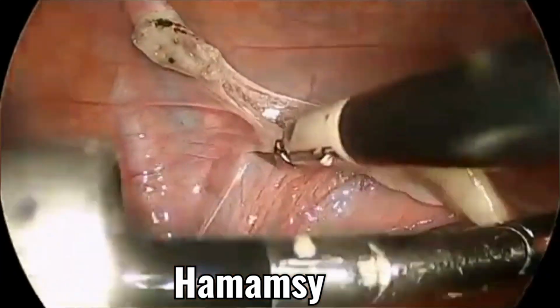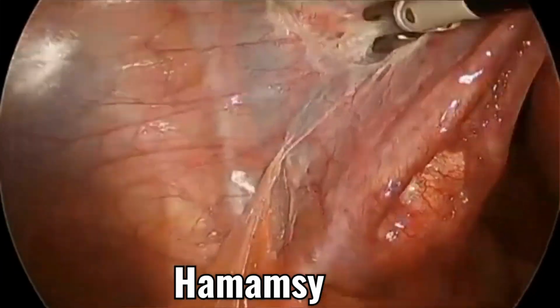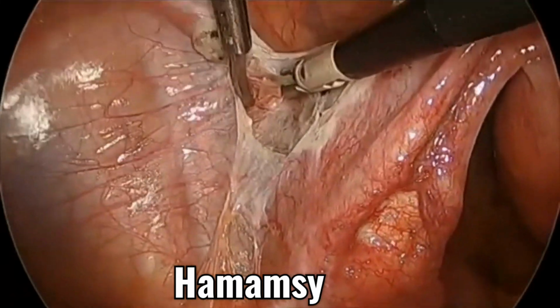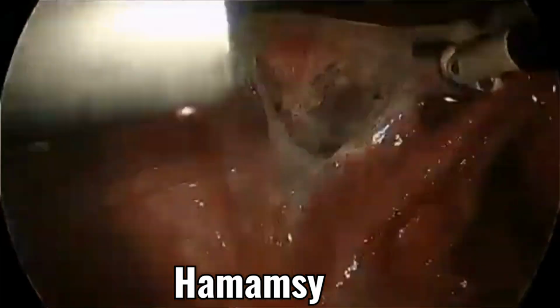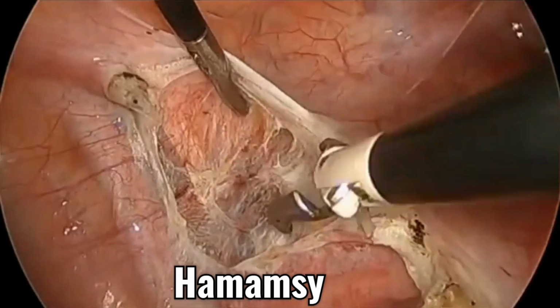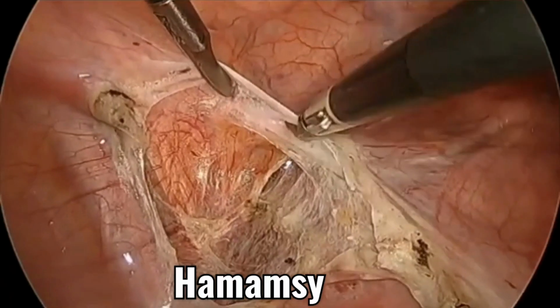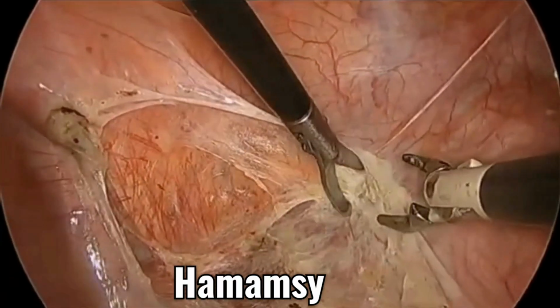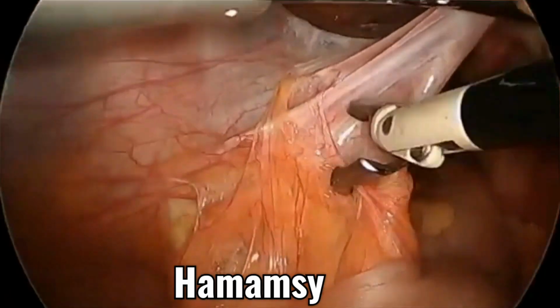The rules of laparoscopic pelvic lymphadenectomy: you must start firstly in radical hysterectomy by lymphadenectomy, not a hysterectomy. Then from lateral to medial, as you see, lymph node dissection is done from three main regions: external iliac lymph node along the external iliac vessels, obturator lymph node along the obturator nerve in the obturator fossa, and lastly, internal iliac lymph node along the hypogastric artery.